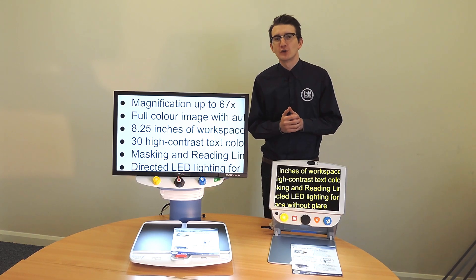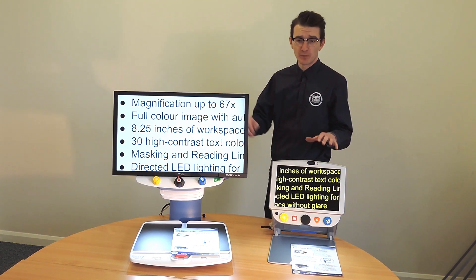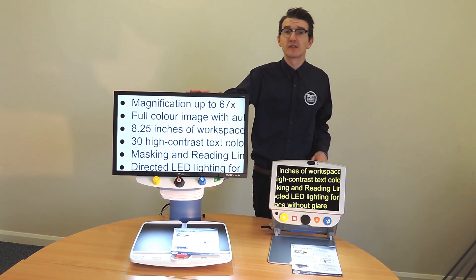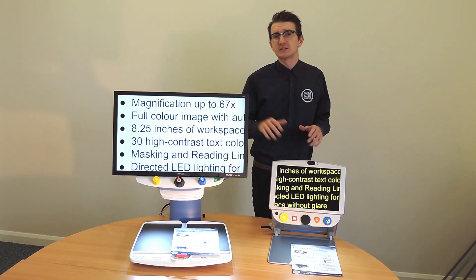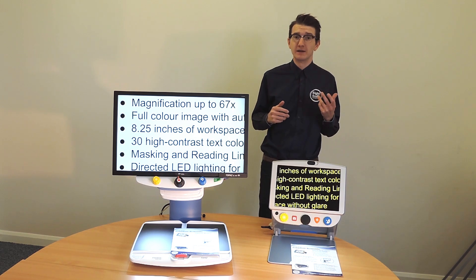Hello and welcome to this Sight and Sound Technology demonstration. Today I'd like to share with you two great products: the Topaz PHD and the Topaz XLHD. The Topaz desktop video magnifiers combine ease of use with powerful features to help people retain their independent lifestyle.